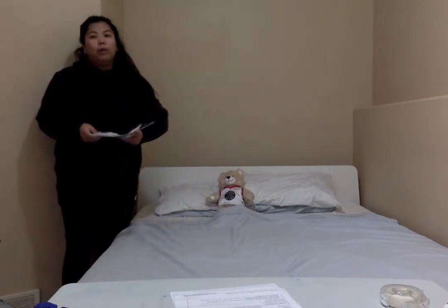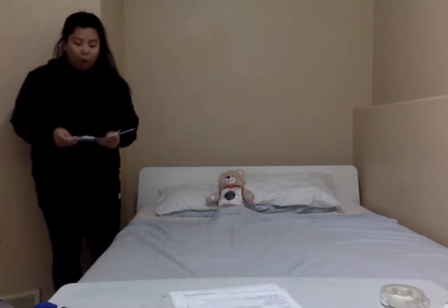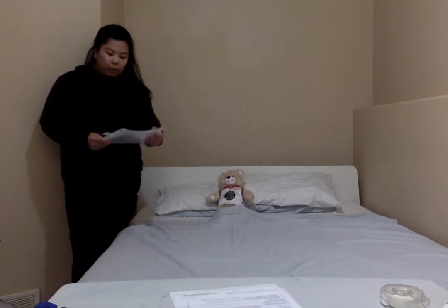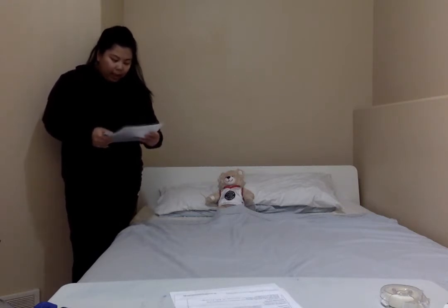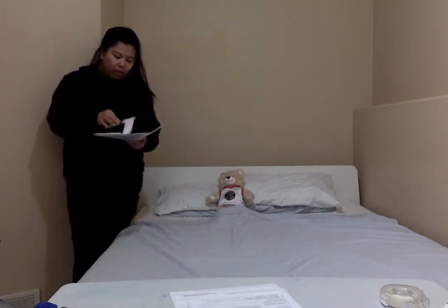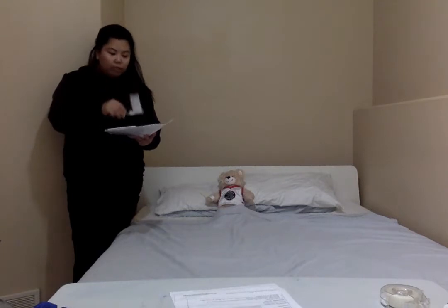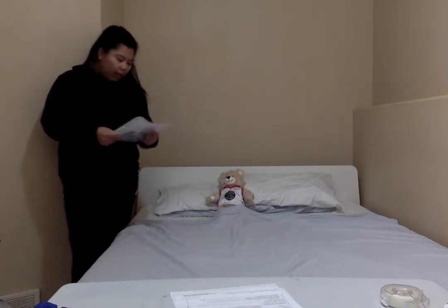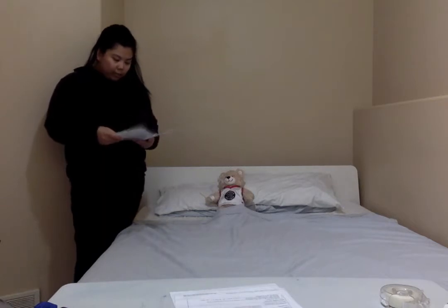So we're doing a third and final check at the patient's bedside. So again, we're checking to see if we have the right patient, Nursing Jake. And then the drug is heparin. The dose is 5,000 units. And then it's 5,000 units per 0.5 ml. On the syringe, I have 0.5 ml. And then the route is subcut. And then the frequency is twice a day.